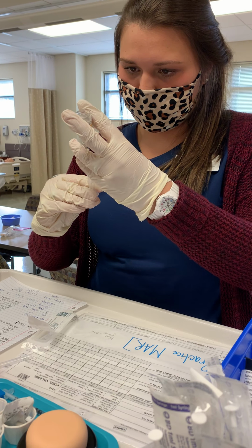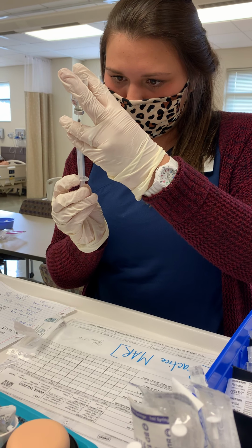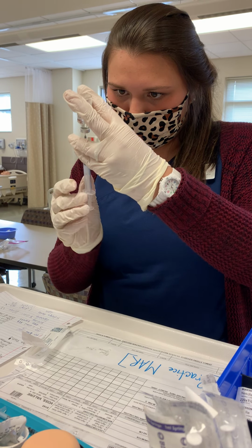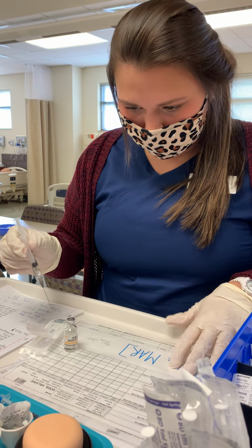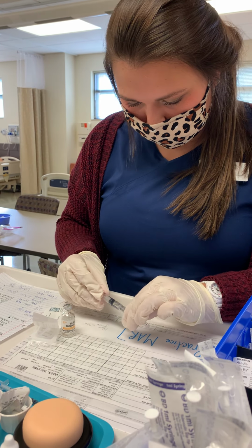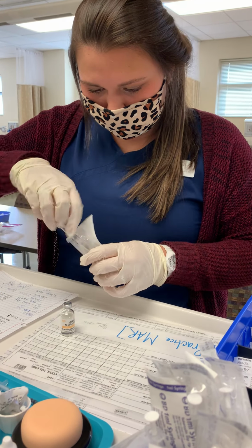I'm going to inject the air and pull back for 1 mL. No air bubbles.